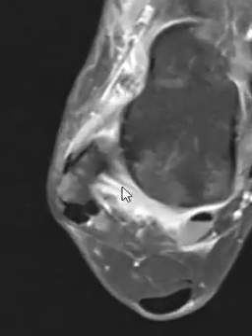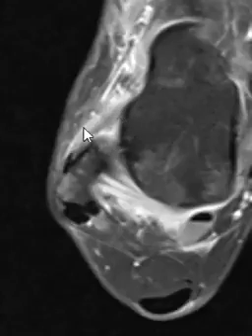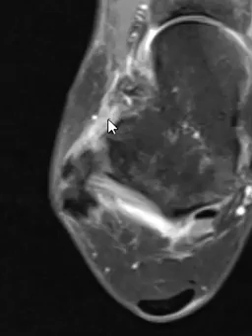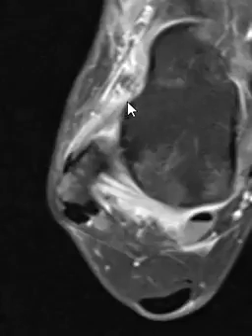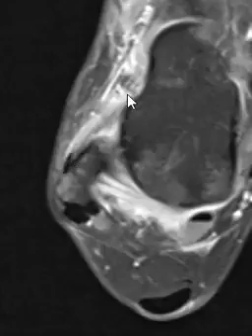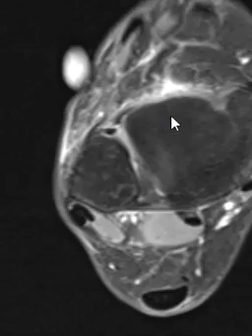Zooming in, this is the fibula and this is the talus, which is below the ankle joint. There is a ligament here — this is the one most commonly torn, called the anterior talofibular ligament. Normally it should be a nice, well-defined black band, but instead this is foggy, thickened, and irregular. This is a high-grade sprain of the anterior talofibular ligament.